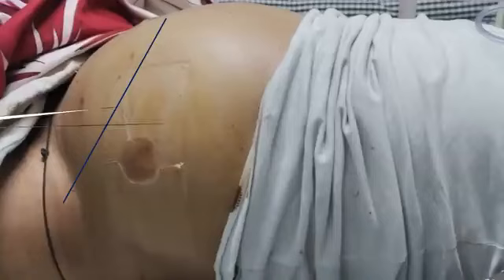Let's get started. First, explain the procedure to the patient and obtain written informed consent. Place the patient in bed with the head elevated 45 to 90 degrees. In patients with obvious and a large amount of ascites, locate an insertion site at the midline between the umbilicus and the pubic bone, about 2 centimeters below the umbilicus.